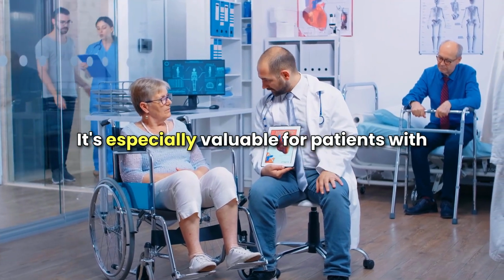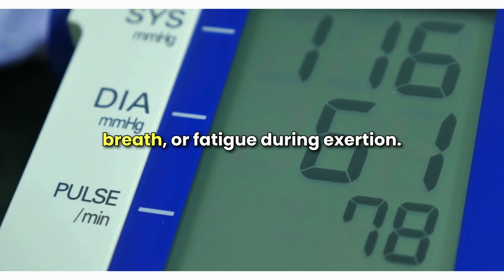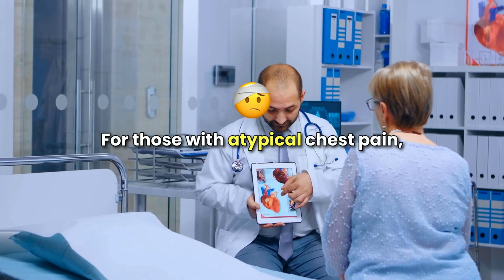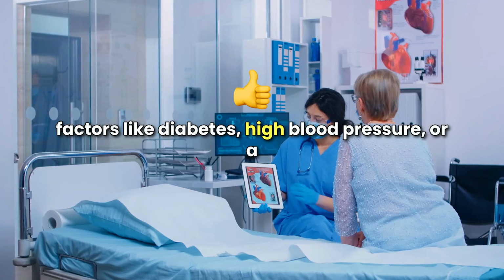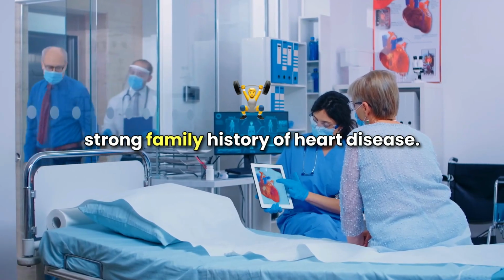It's especially valuable for patients with symptoms like chest pain, shortness of breath, or fatigue during exertion. For those with atypical chest pain, the test helps determine whether the symptoms are related to heart disease. It can also be used for high-risk individuals who may not show symptoms but have factors like diabetes, high blood pressure, or a strong family history of heart disease.